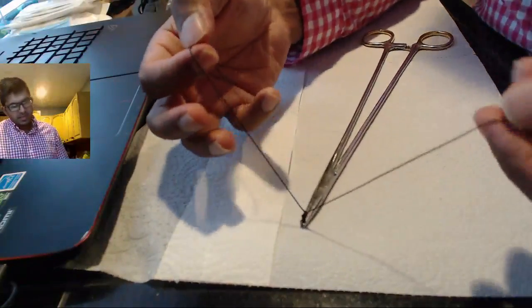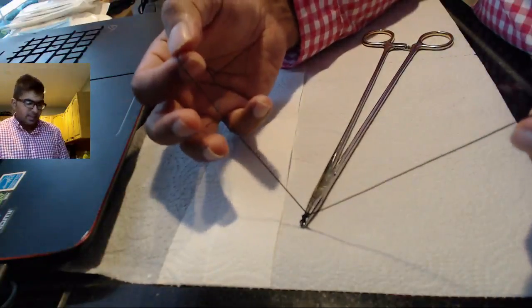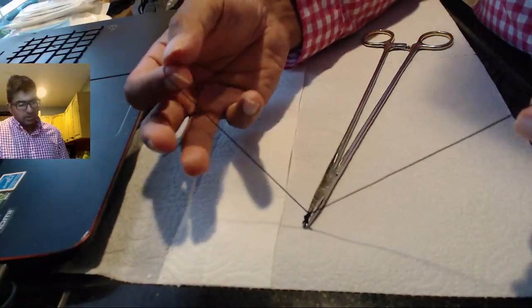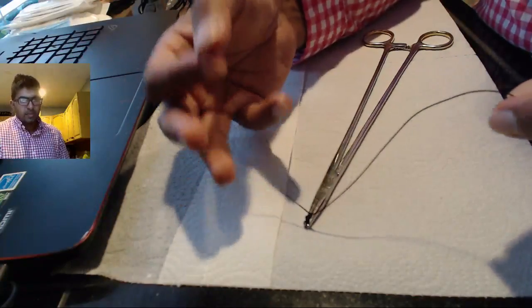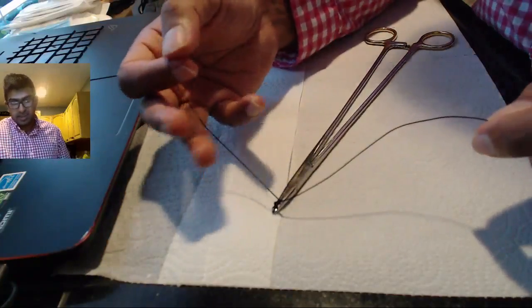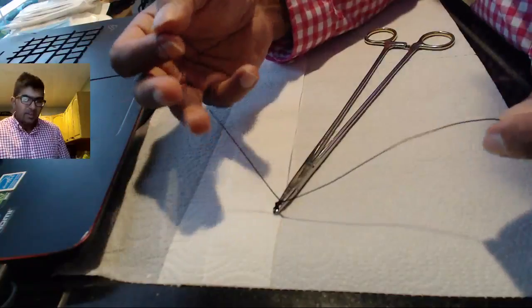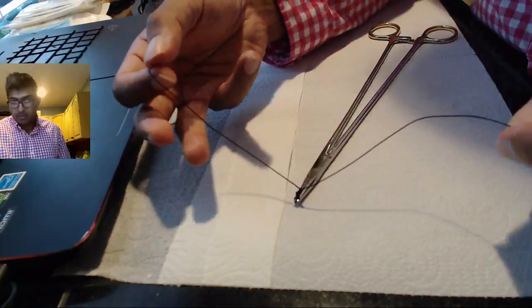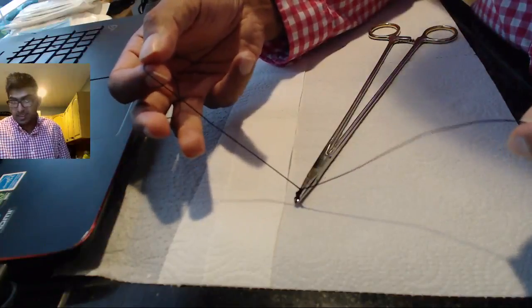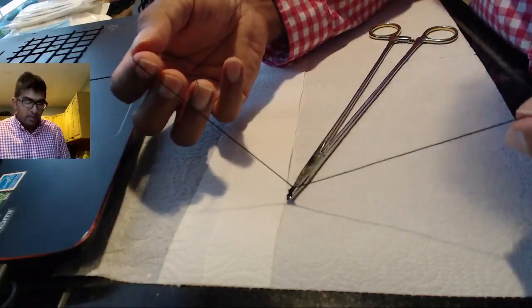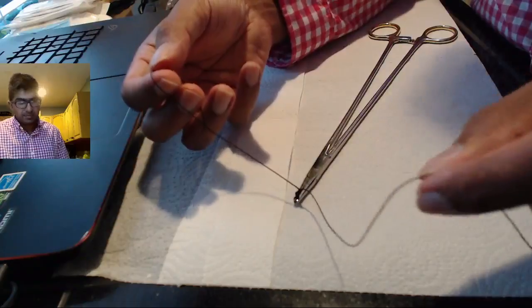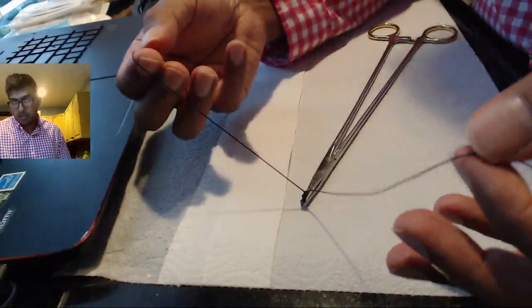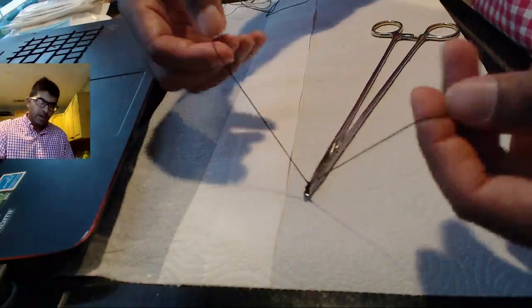And this is actually very important. And the reason for this is that you always want to have the knot tied secure. And if you bring your finger down routinely and you practice as such, or this is your first time learning, if you just learn it correctly, then you never have to worry. If you don't tie down a small side branch of a vein bypass, it's going to bleed out. And every once in a year, this happens. And unfortunately, it causes complications with the patients. So, by ensuring that you're practicing tying down correctly, you'll never have to worry about this problem for yourself.